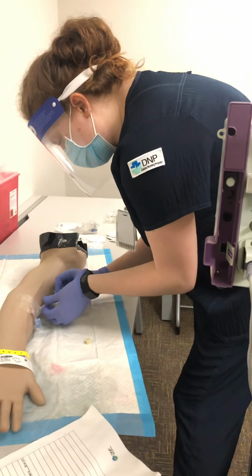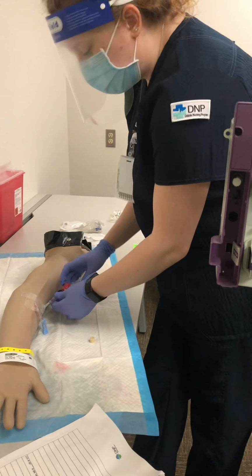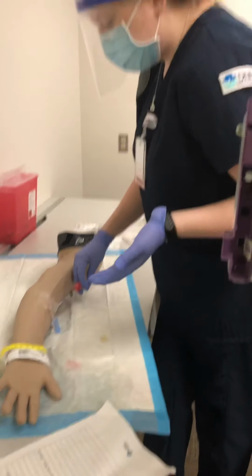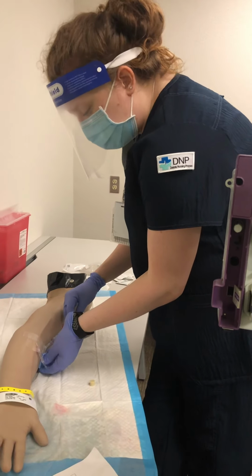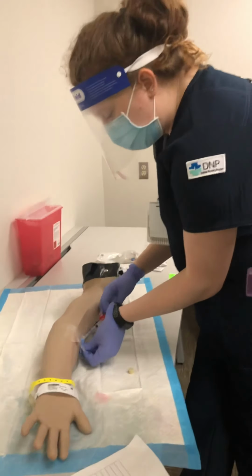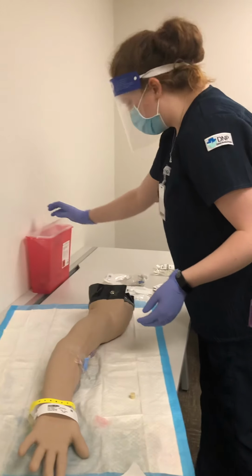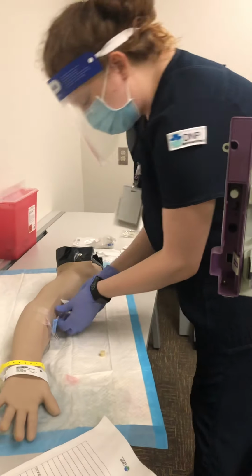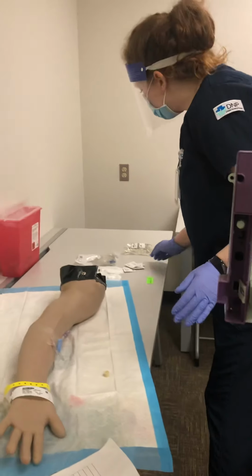Okay, so for morphine, for this dose, we are going to administer it over a course of about 2 minutes. However, for the sake of demonstration purposes, we're going faster than that. But we know that it'd be over the course of 2 minutes to prevent any patient discomfort or harm. So I'm locking that back up. Take this out. This goes in the sharps because it had morphine in it. So we are cleaning the port again for 30 seconds and allowing it to dry. And we're going to do another flush to get all that medication out of the line.